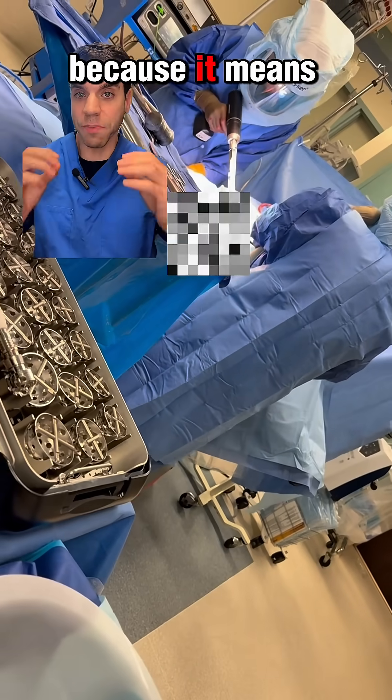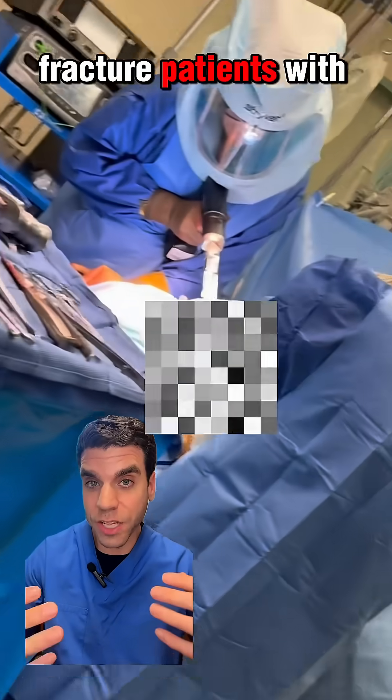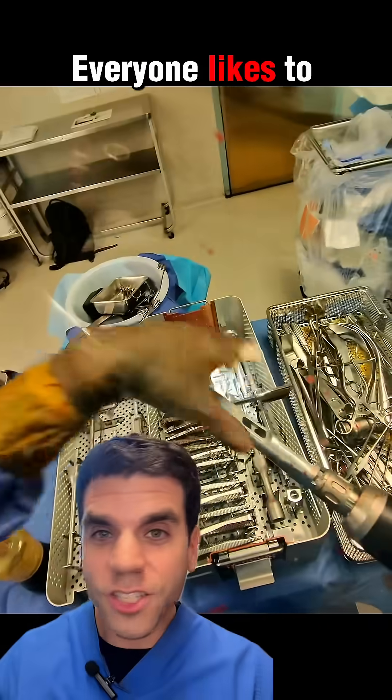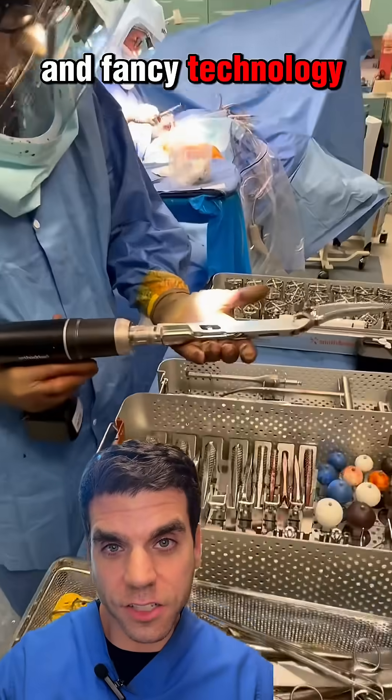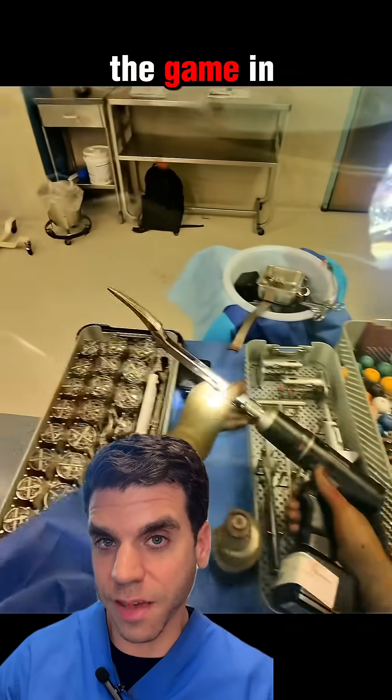And this is great because it means that people with weak or brittle bone, like old hip fracture patients with osteoporosis, are much safer. Everyone likes to talk about robots and fancy technology, but sometimes it's simple innovation like this that really changes the game in surgery.